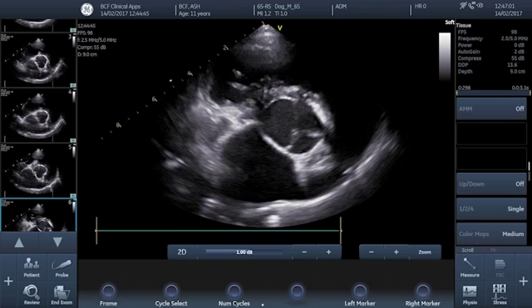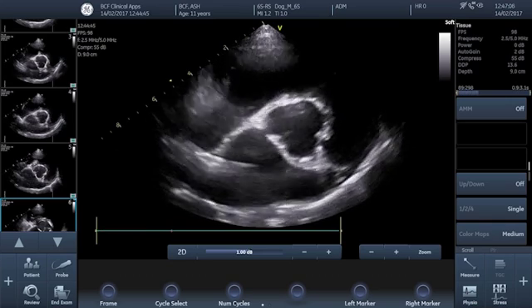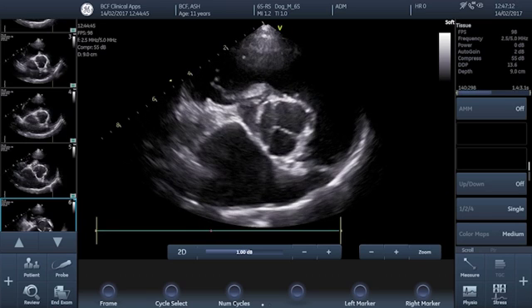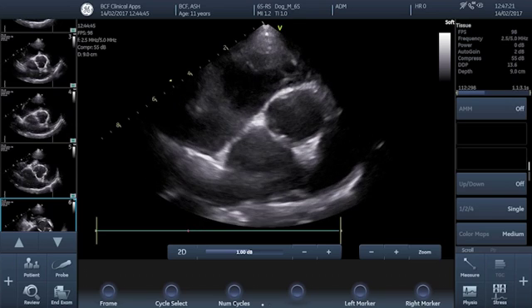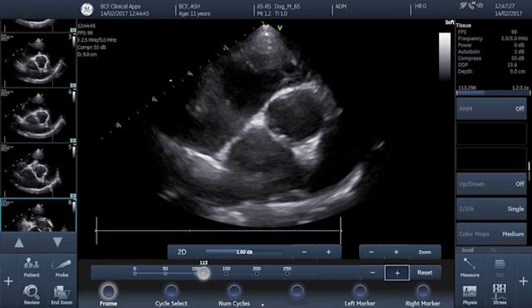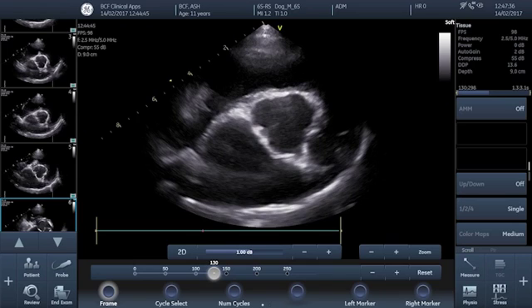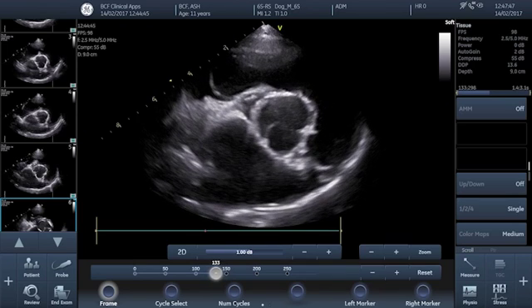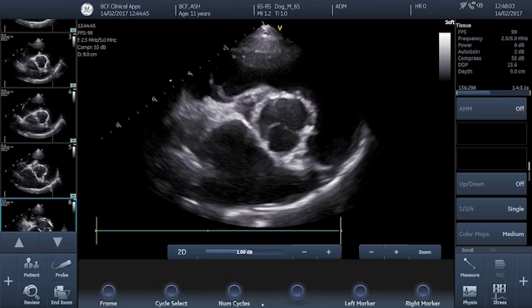Once you've stored your cine loop, load it up and use your trackball or trackpad to scroll forwards and backwards through the cine loop timeline. What we're looking to do is to get the first frame in which the aortic valve leaflets have closed — so the first frame in which we can see the Mercedes-Benz sign following systole. Usually you'll scroll grossly forward and backwards, and then use fine control to skip forward or back one or two frames at a time to make sure you accurately identify that first frame in which the aortic valve is closed.